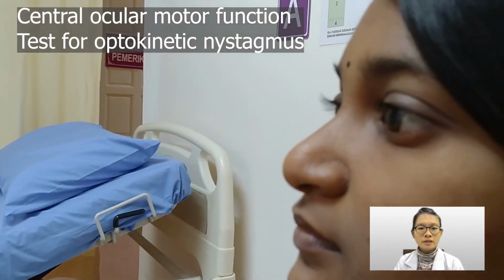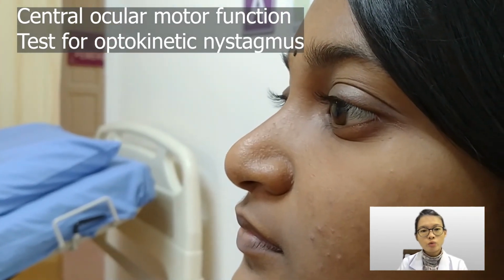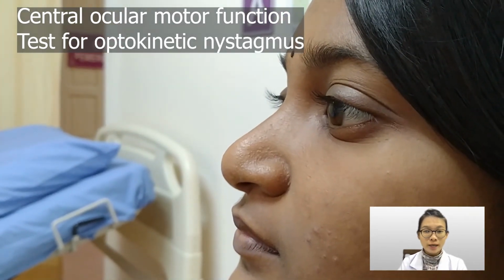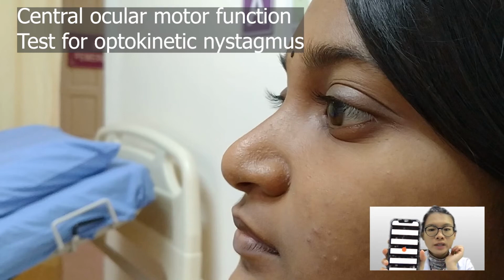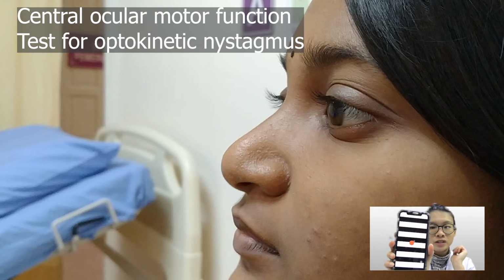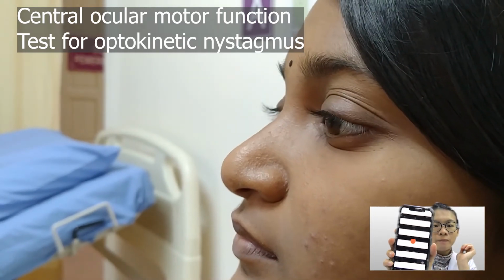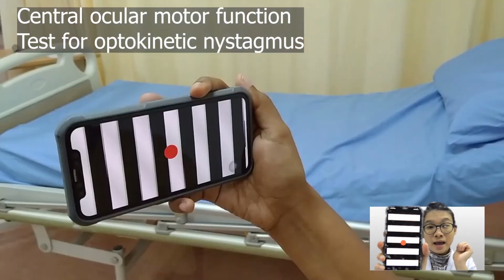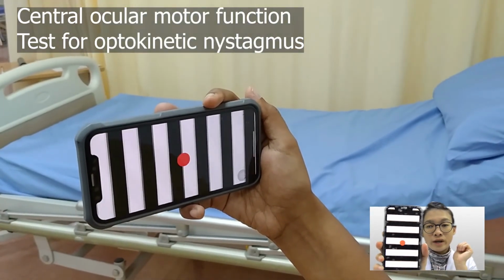OKN is a physiological response produced by asking the patients to visually track a succession of moving stimuli. Here we are using an OKN stripe in a smartphone application. By clicking on the screen, the speed of the OKN rotating drum increases. Ask the patients to look at the display center and count how many dark bars pass the display center, and we observe for any asymmetrical OKN response.